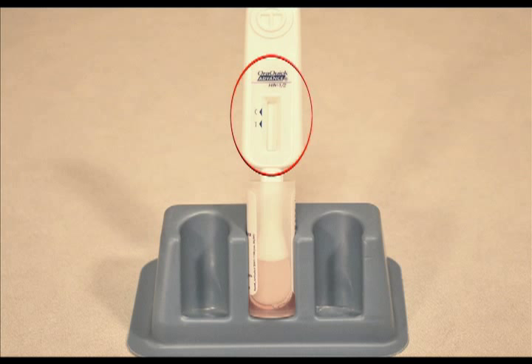An invalid test result means that there was a problem running the test either related to the specimen or to the test device. An invalid result cannot be interpreted. Repeat the test with a new divided pouch and a new sample.